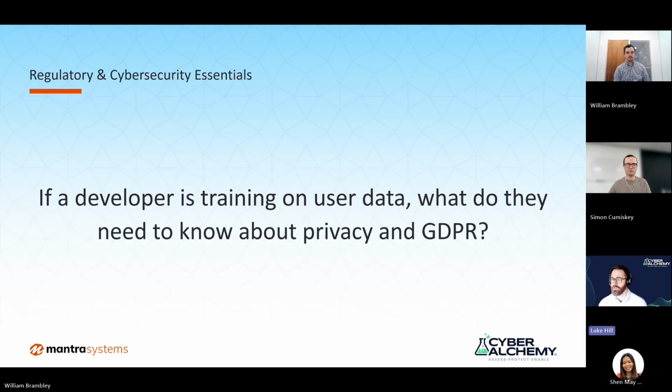If you are processing or controlling a lot of data like that, you really need to be thinking not just about the security of your product, but also the security of your organization, to ensure that you've got good castle-like defenses all around your perimeter, and also around where you're actually having that development take place. You wouldn't want an attacker to traverse from something as simple as a phishing email, which I'm sure many of the people see day in, day out, and then go into that data repository where this user data is being stored from that account, because you've not got the correct access control and other controls in place. So data is a wonderful asset, but it also is a liability, so it should be treated as such.